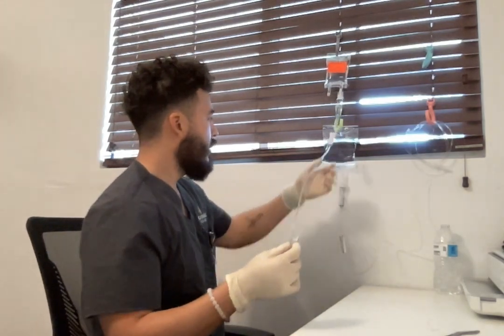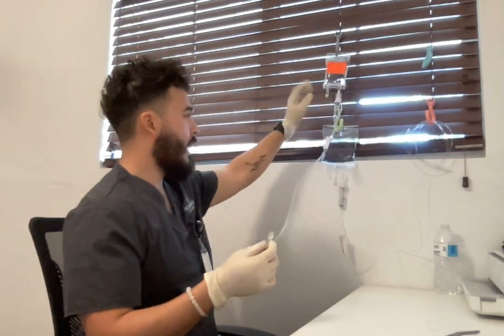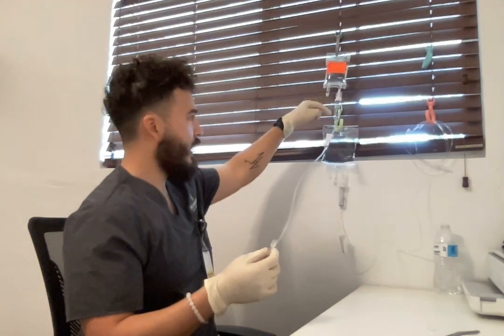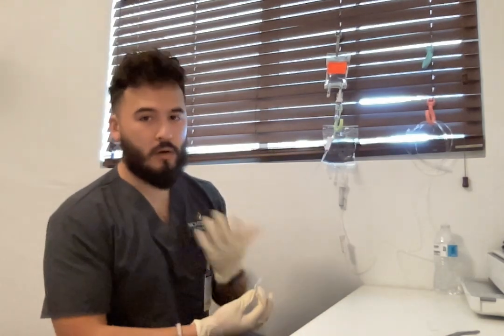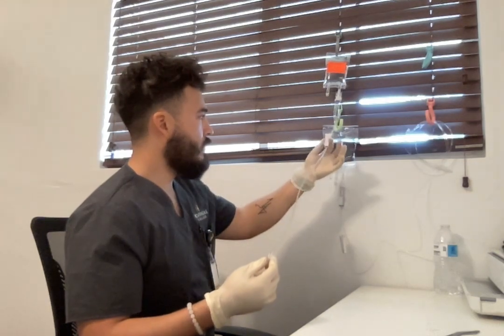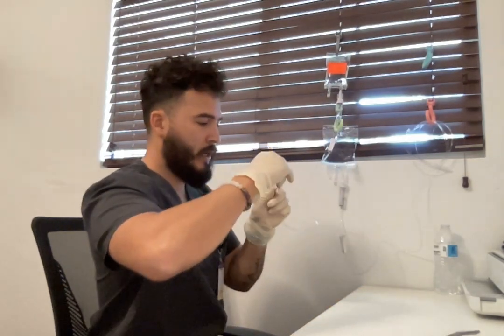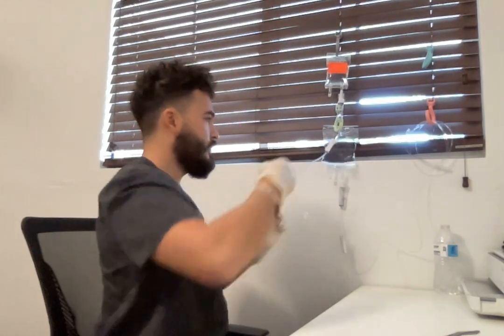All right. So now the medication bag, I want to ensure that I have 100 drops per minute. So I'm going to slowly release the roller clamp, count for one full minute until I have 100 drops coming out every minute. For the sake of the video, I'm not going to count a full minute, but unclamp, make sure I have 100 drops per minute. Once that's ensured, I'm gonna put this cap back on. Okay, now we're ready to connect it.